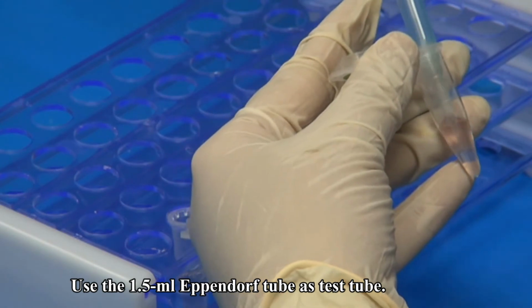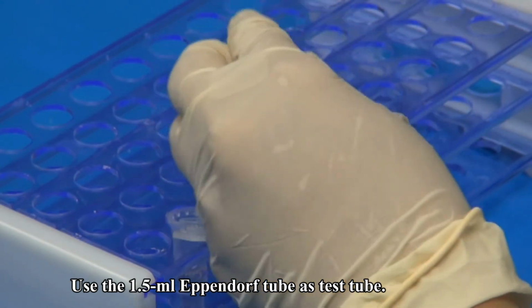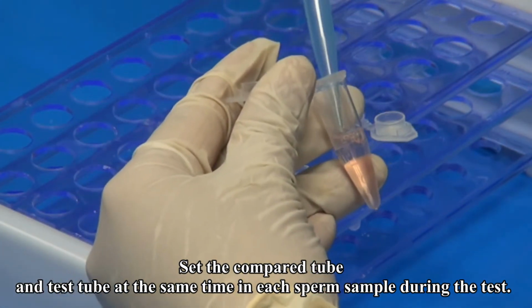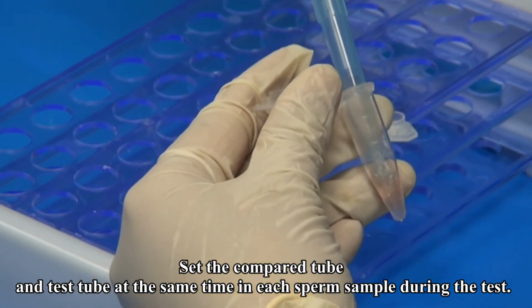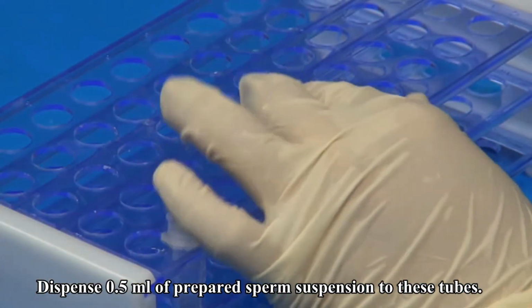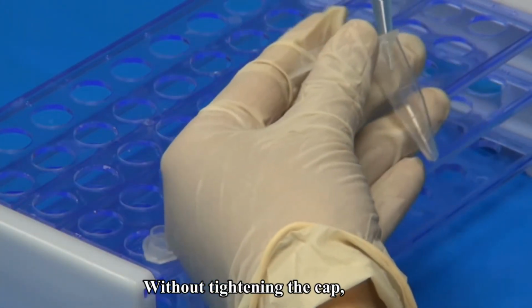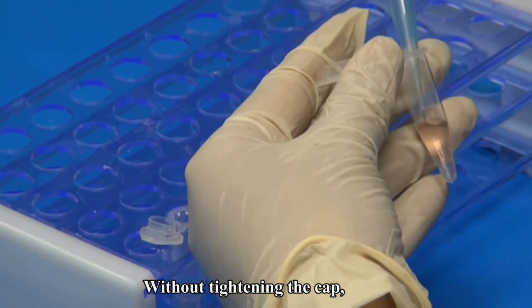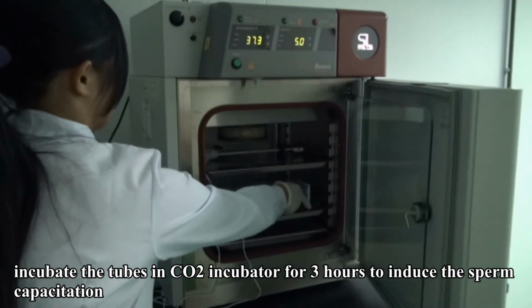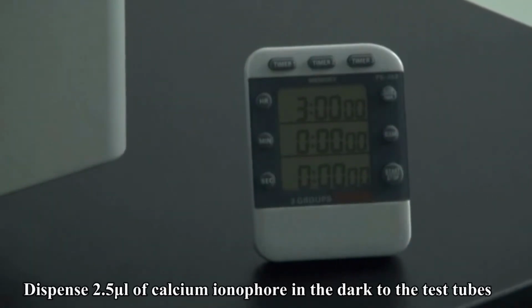Use the 1.5 ml Eppendorf tube as the test tube. Set the compared tube and the test tube at the same time in each sperm sample during the test. Dispense 0.5 ml of prepared sperm suspension to these tubes without tightening the cap. Incubate the tubes in carbon dioxide incubator for 3 hours to induce the sperm capacitation.